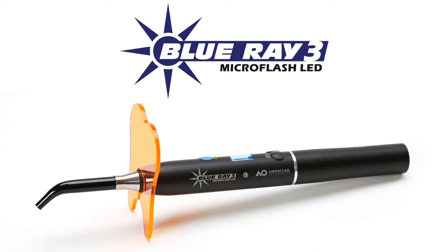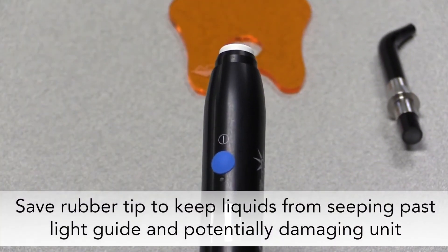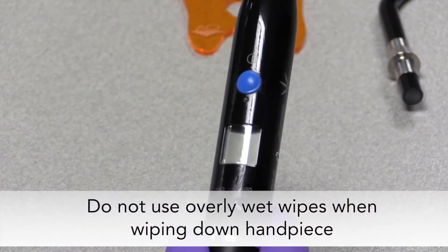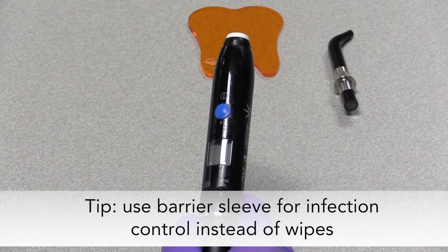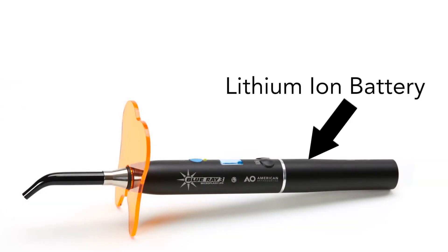Now that we've talked about some of the main features, benefits, and how to use the Blu-ray 3 curing light, let's talk about some best practices to get the most out of your curing light. Save the rubber tip that came with the curing light to keep liquids from seeping into the handpiece, which could potentially damage the internal electronics. Be careful when wiping down the handpiece to avoid using overly wet wipes. Another option for infection control is to use a barrier sleeve instead of wipes. Blu-ray 3 uses a lithium ion battery because this type of battery stores a large amount of power in a relatively lightweight battery.